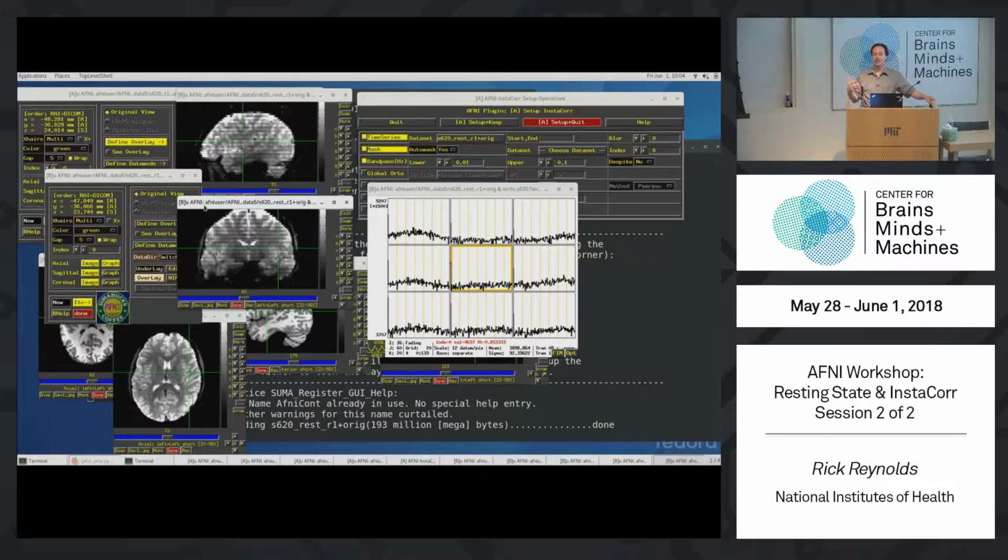Why do we get it? Well, remember this magnetization for the gradient is being passed over the data. How does that happen? When it first starts off, you get a large MRI signal. I'm not going to get into the physics much, but at the very beginning, you get a big signal due to this. But it's going to pass over slice 0, 2, 4, 6, 8, et cetera, and then 1, 3, 5, 7, 9. But it bleeds.